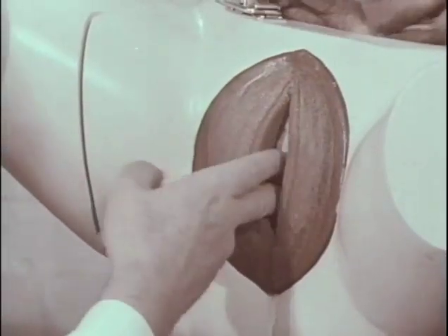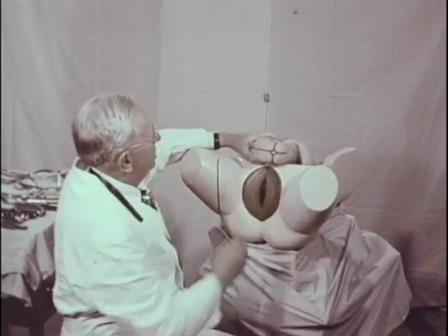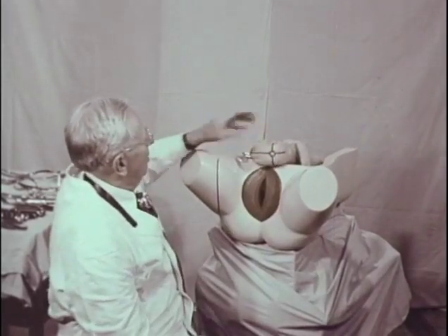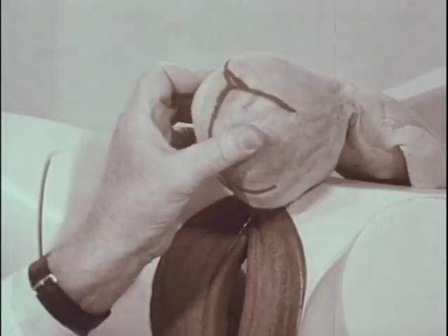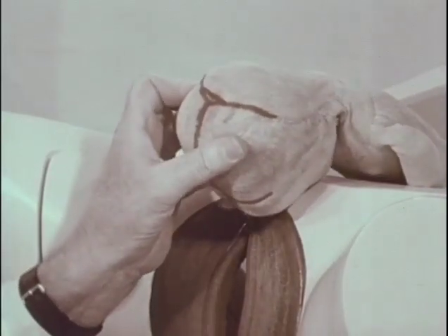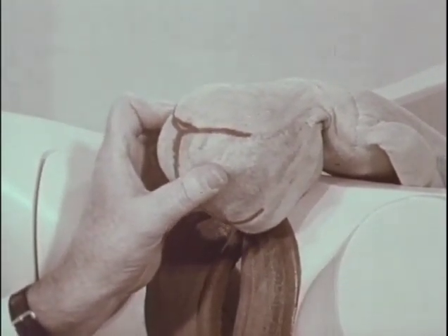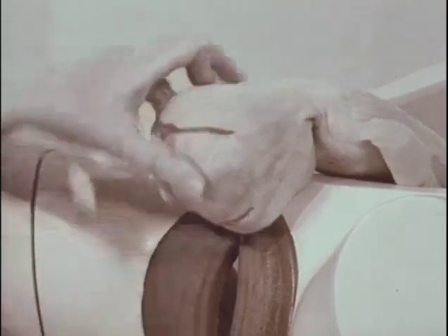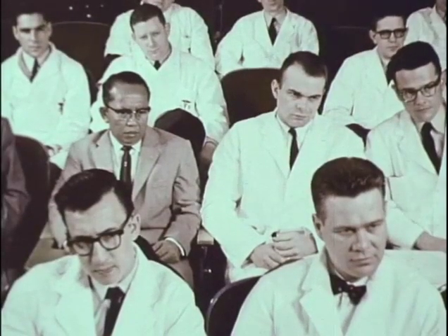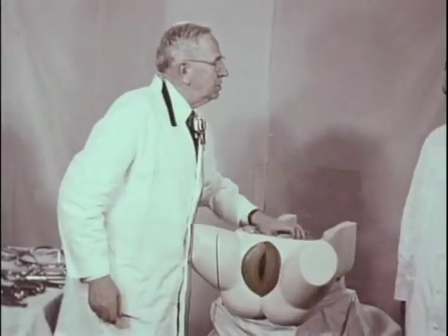For the ROT position, the same procedure is reversed, but the rotating hand is the left hand, and it's necessary to cross the handles in order to lock them, because the lock is on the left shank. Next, we proceed with the posterior positions.